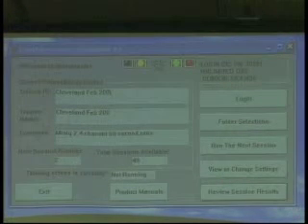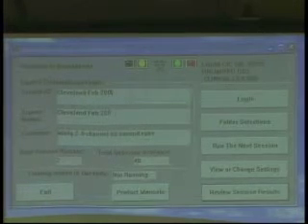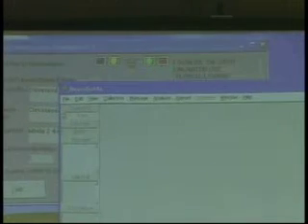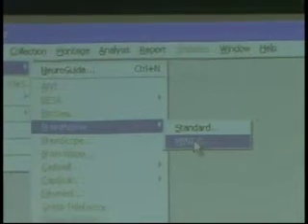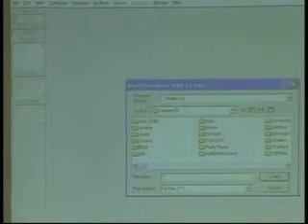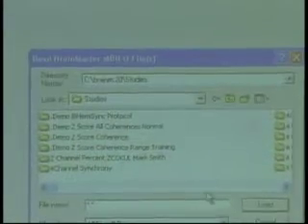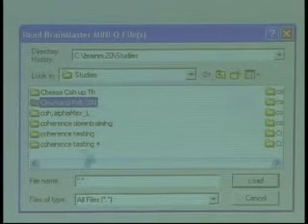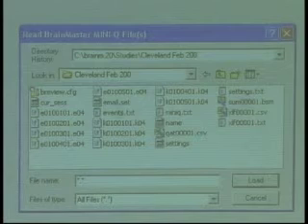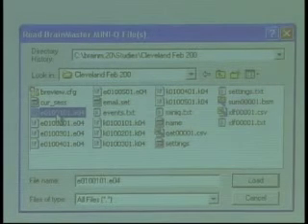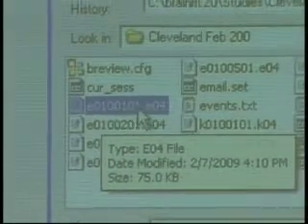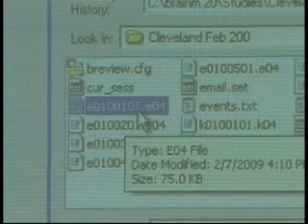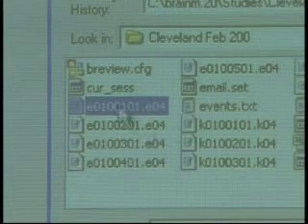I go to my start menu and I'm bringing up NeuroGuide for BrainMaster. Here's NeuroGuide for BrainMaster — so we now can get access to these WAVE records. We go File, Open. BrainMaster Mini-Q. We're on disk C, we go to BrainM.20, then to Studies, and we look for today's study. Everything is in alphabetical order — there it is: Cleveland, February. I go in there and there are my EEG records. Wherever I see the E, that's an EEG record. E01 — 00101 means session one, run one, first pause. We didn't even do any pauses, but there it is. I'm going to go Load.